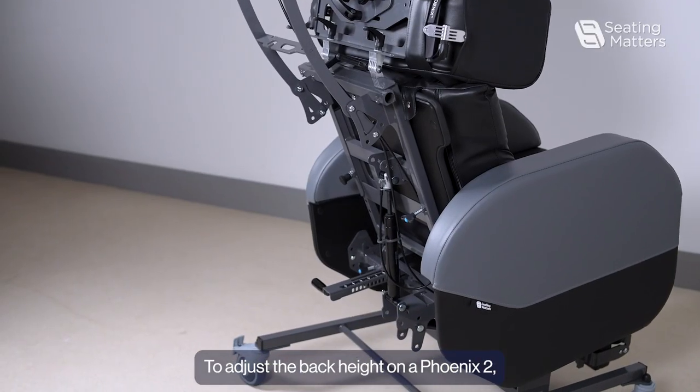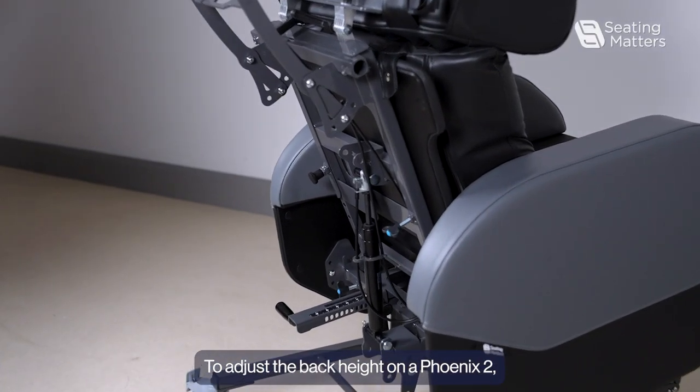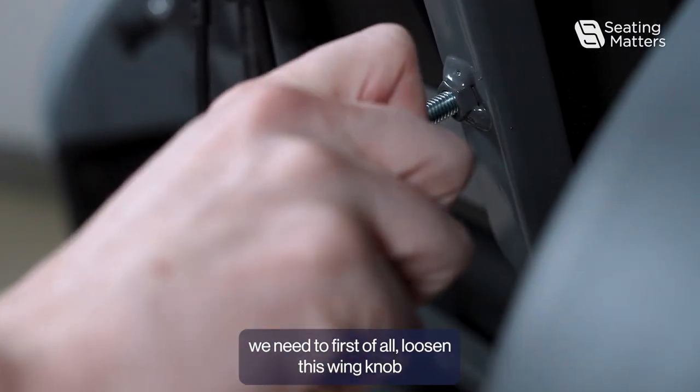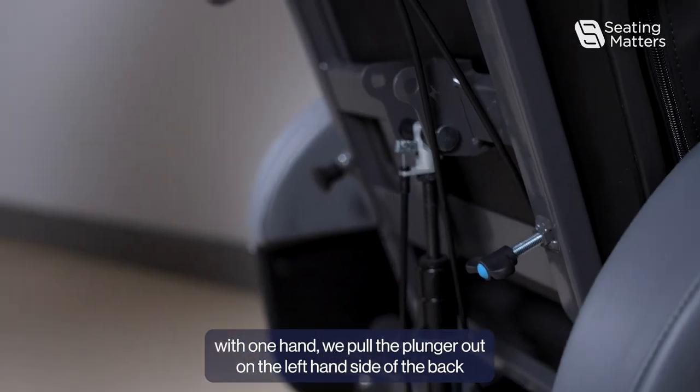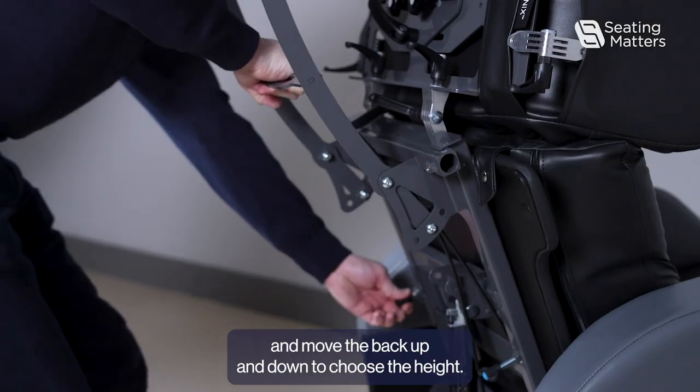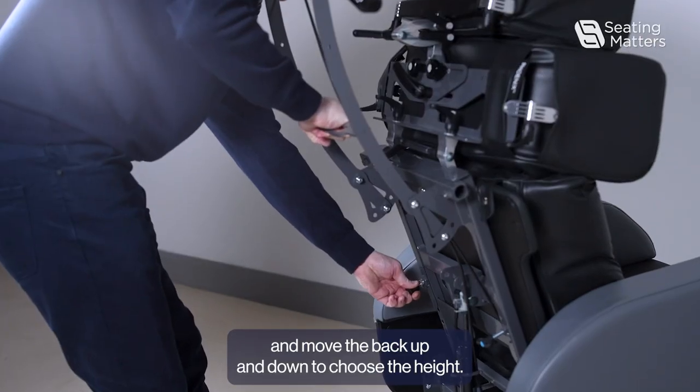To adjust the back height on a Fenix 2, we need to first loosen the wing knob, then holding the back with one hand, pull the plunger out on the left hand side of the back and move the back up and down to choose the height.